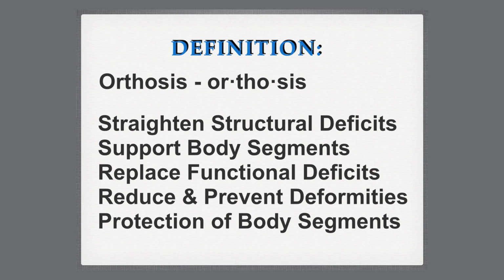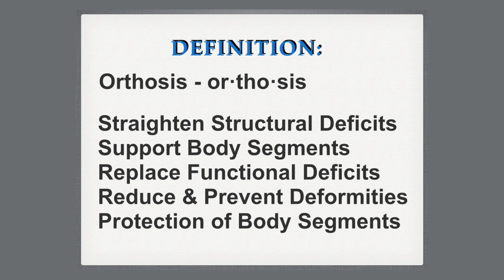So the protection of body parts. A lot of times what we do is protect body parts. If there's a broken bone, we support it and protect it in good alignment until that heals. But there are other things that we could do as well for protection.